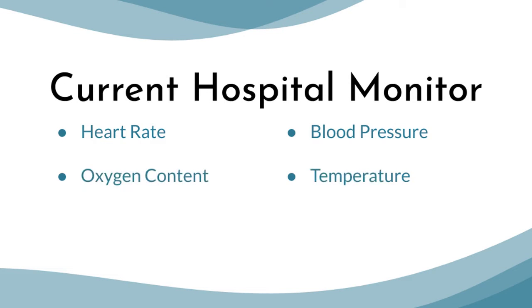The current state-of-the-art monitor typically measures heart rate, blood pressure, oxygen content, temperature, and respiration rate. However, only heart rate and sometimes blood pressure is sonified. Heart rate is represented audibly as rhythm and blood pressure as pitch. In addition to standard blood pressure as pitch, we suggest adding a third data point.